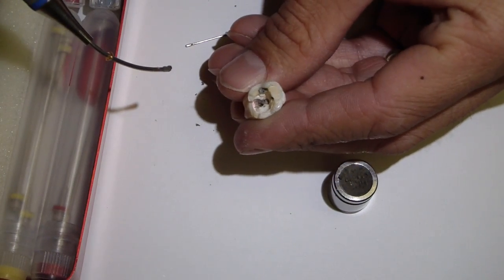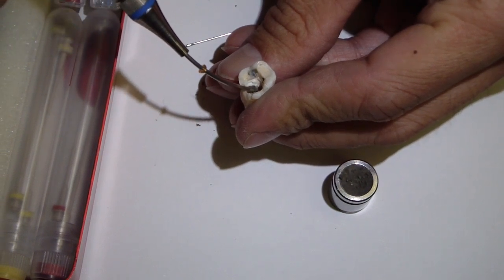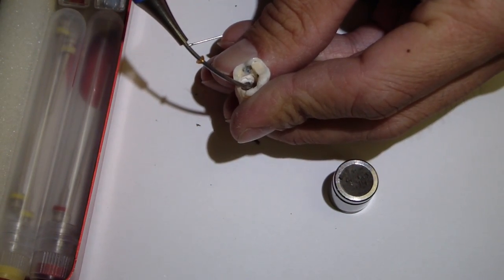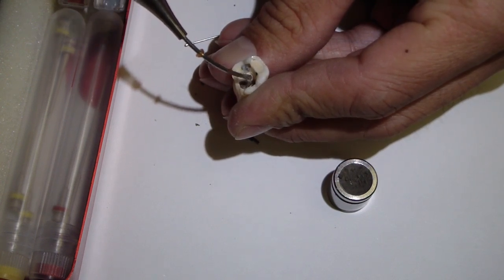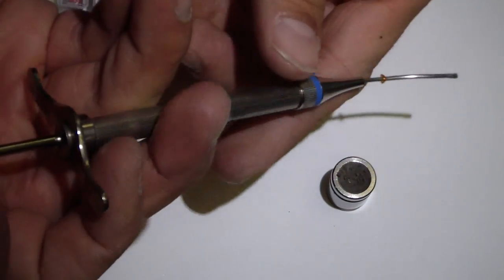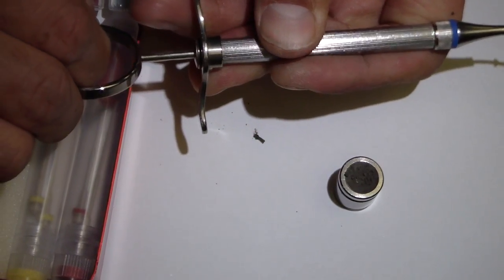Say, for example, I've done this once, perforated right in the middle. And there's a good example of what I did wrong. What I didn't do is I didn't pull back on the syringe to make sure. You heard that click.